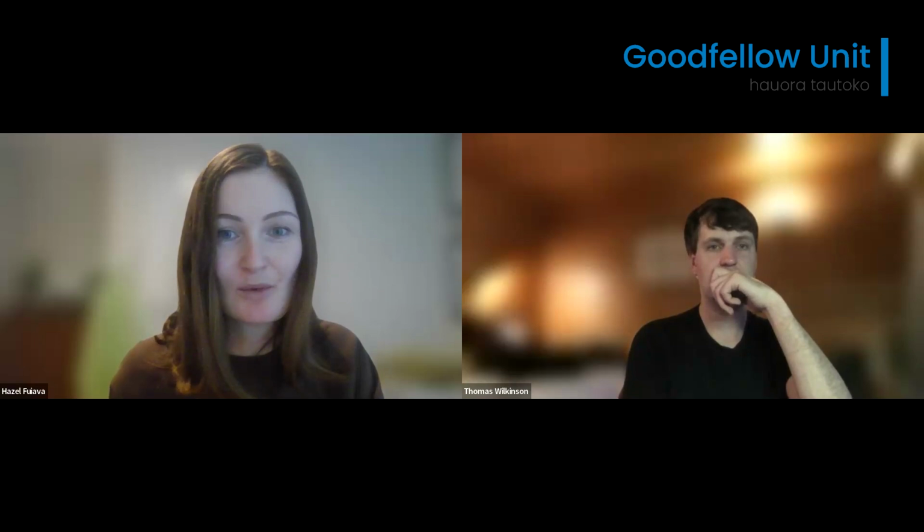Managing hypoglycemia with an AID, do we go about counselling patients the same as if they weren't on an AID, or is it different? Oh, that's a really important point. Thank you for bringing that up. Generally you need much less to treat hypoglycemia on an AID system than you do on injections, and this can catch people out. And that's simply because with AID, you've got short-acting insulin only.